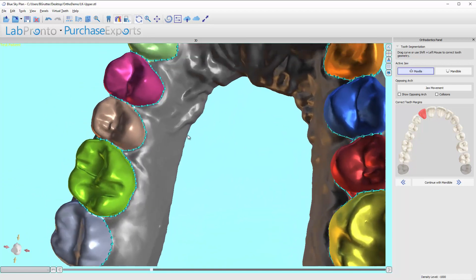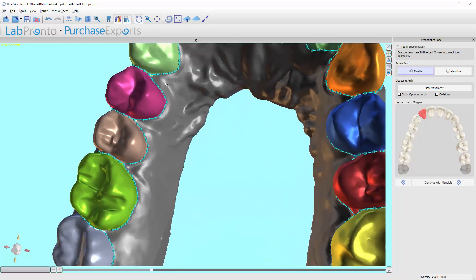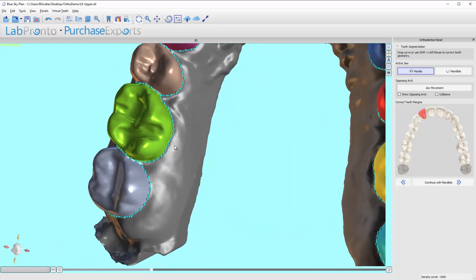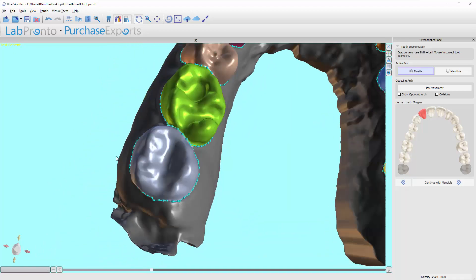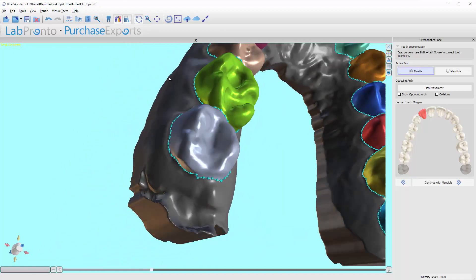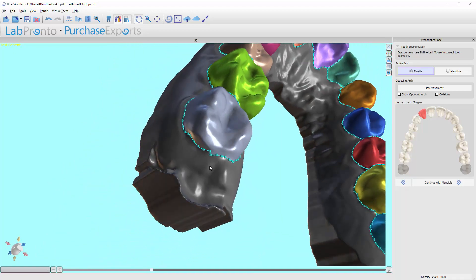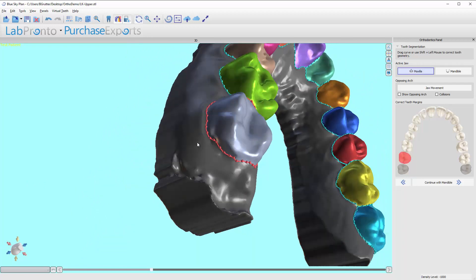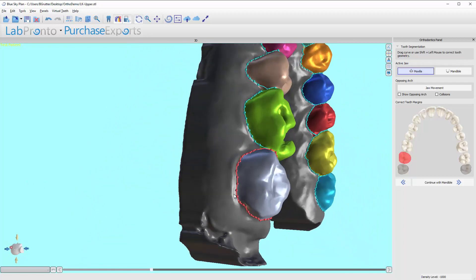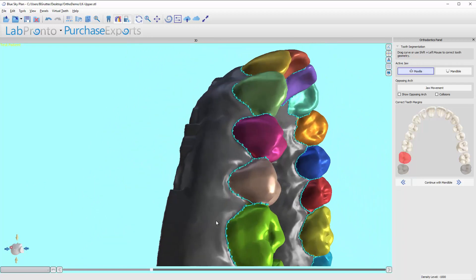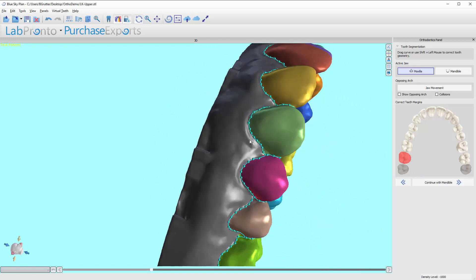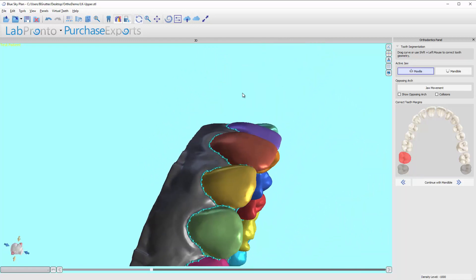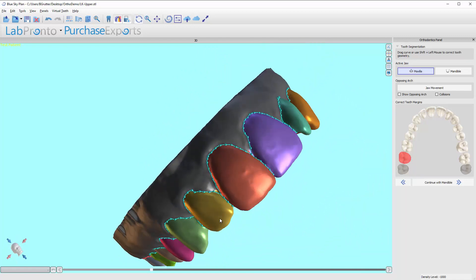I look around at all the embrasures and make sure everything looks pretty good. It does not have to be perfect, but we want it to be fairly ideal. If you see an area like this, you can move the one node. Or if you see a problem area, you can always redraw the line.